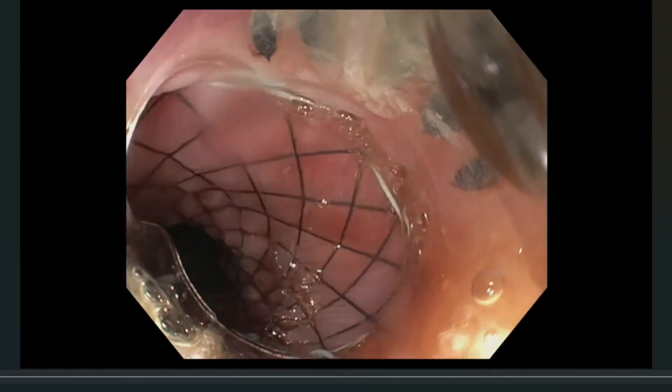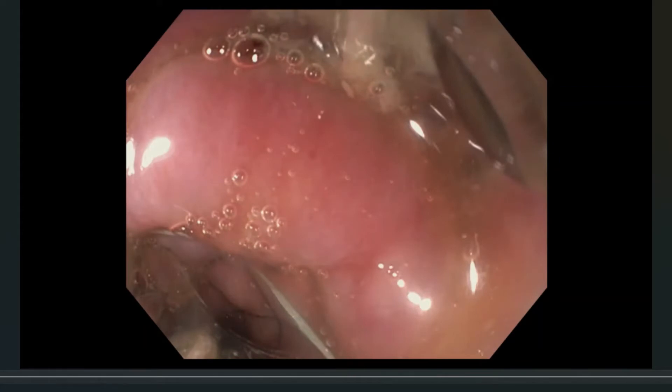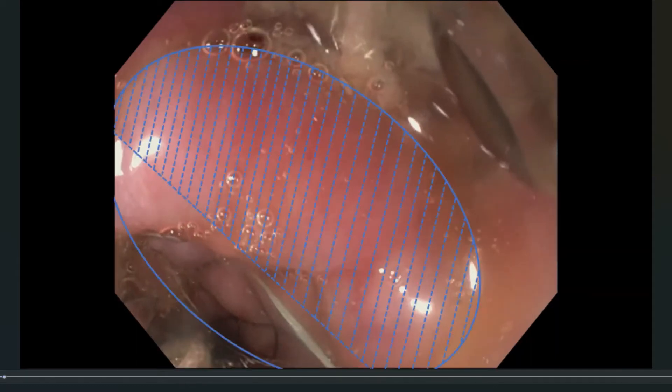Once you've loaded the stent fix device at the tip of the scope, you approach the proximal end of the stent — here is the esophagus — and you want to align the stent fix cap, which is a bit of an oval shape as demonstrated here. If you divide the oval space at the tip of your scope and within the cap into thirds, you want approximately two-thirds of the space in the cap to be occupied by the mucosa, and one-third by the stent — the proximal flanges, the proximal end of the stent.